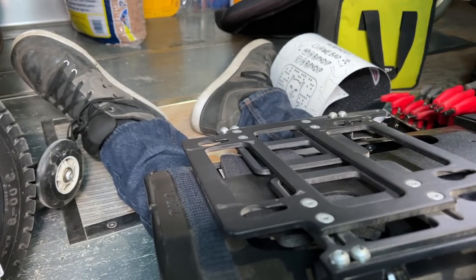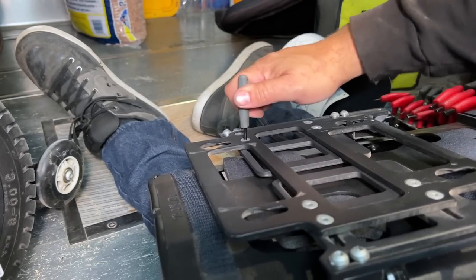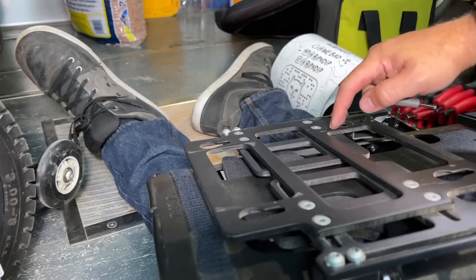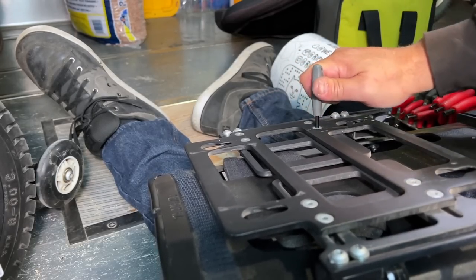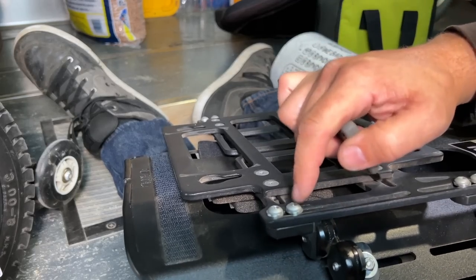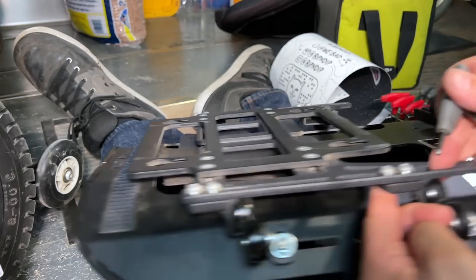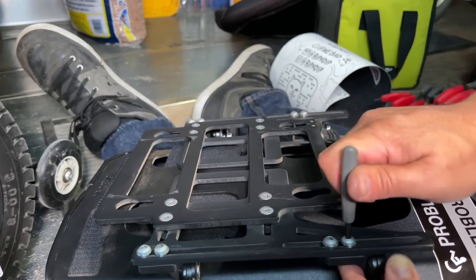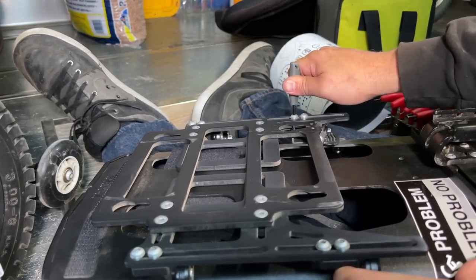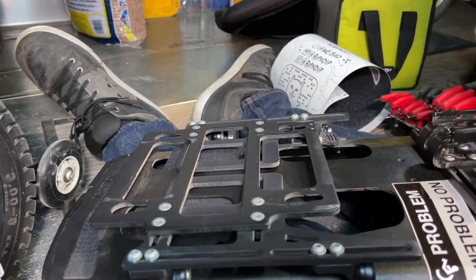While I've got this thing on my lap, I'm just going to go through and check the rest of these bolts and make sure they are, in fact, tight, because over time these things can come loose, or maybe they weren't torqued to begin with. Whatever the coating is on this kind of creates a little friction layer — that's what that snapping noise is. Some of these were a little bit stripped out too, but I got a little bit of turn out of these. That's the thing with direct backrest adapters on Permobils — there are a lot of connection points and over time stuff can understandably work loose. It probably wouldn't hurt to take all this apart and use Loctite, but after a year of use, this stuff is barely even loose.